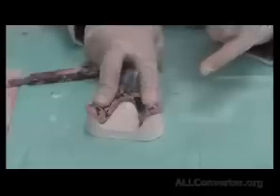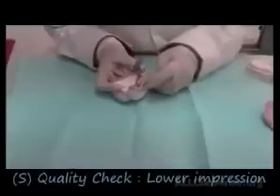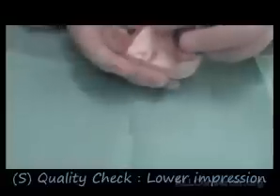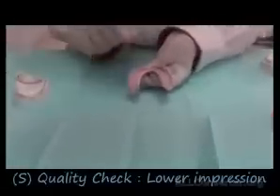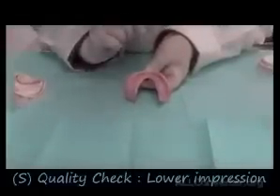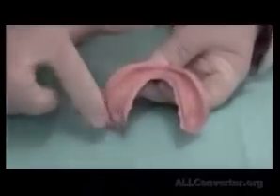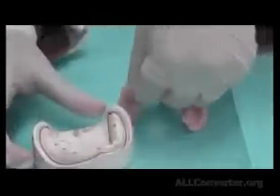We maintain our pressure and do our finger test. After we have finished all the border movements and the impression material is now set, I'm doing the test by my fingernail. I can take it out of the patient's mouth, and we could find that we have the material all around continuously. We have the sulcus continuously recorded all around, extending to the full depth inside the lingual pouch. If I had the patient here, I would take a measurement with my finger into the lingual pouch and see have I recorded this or not.